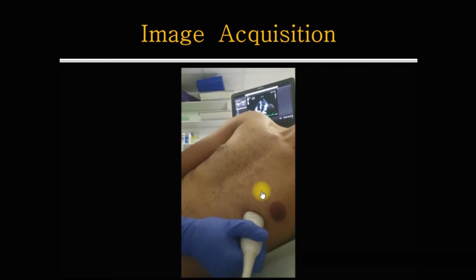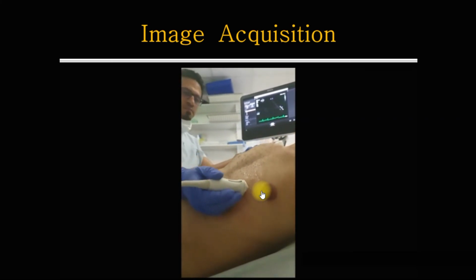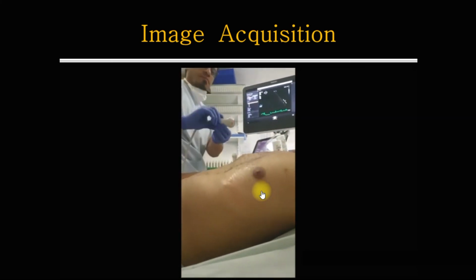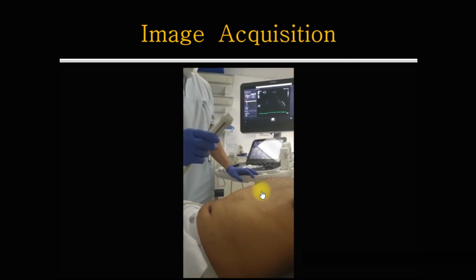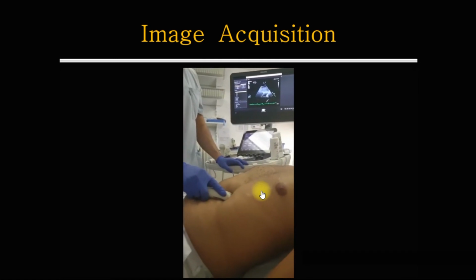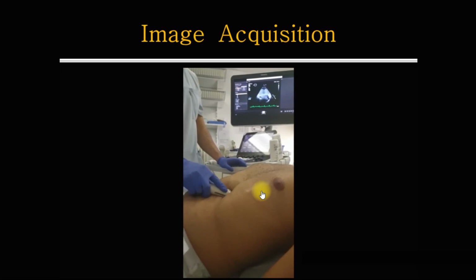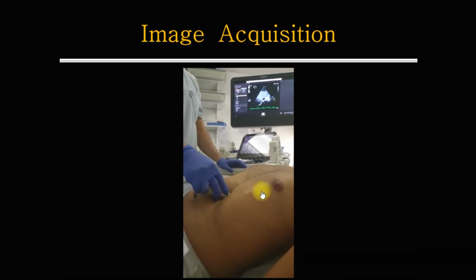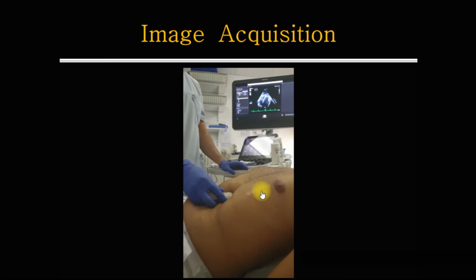One more time, apical 4, apical 2, or 12 o'clock, apical 3, all with rotation. Here is our view, the subcostal view. The marker should be pointing toward 4 o'clock almost. The patient should take a deep breath and hold it, then we'll see our view. With slight rotation from 4 o'clock toward 1 o'clock, you can see the inferior vena cava.